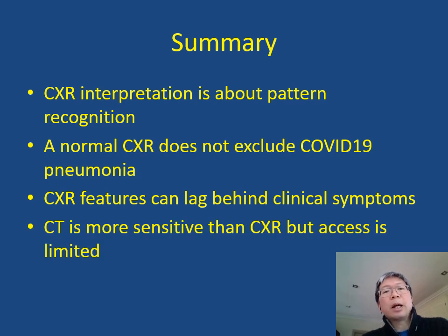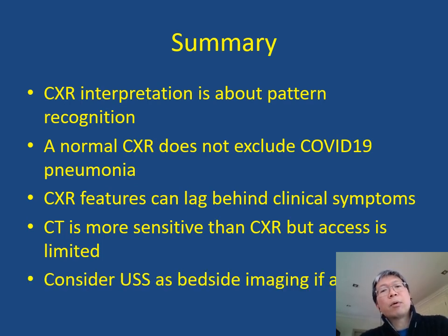CT is clearly a more sensitive imaging modality than chest X-ray, but the access to this service is limited, and it carries with it a greater radiation exposure. One should consider, therefore, bedside ultrasound imaging as a point of care test if local expertise is available.